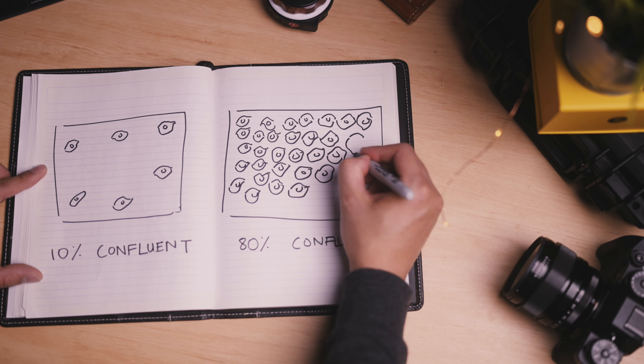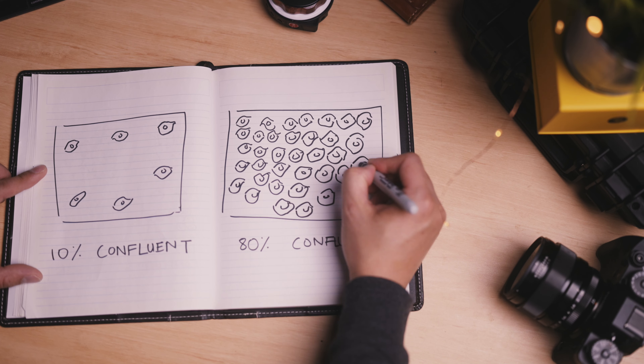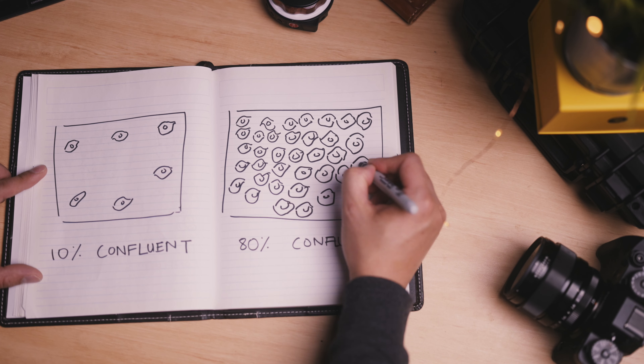You should monitor your cells once every day to assess their growth and overall health. We can do this with a microscope — an inverted phase contrast setup. What you're looking for is how much of the flask surface is occupied by the cells, also known as confluency, and the absence of any contaminants. When about 80% of the surface is covered by cells, they should be subcultured.